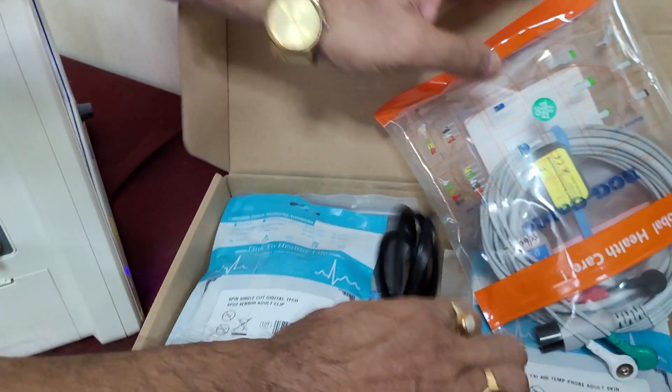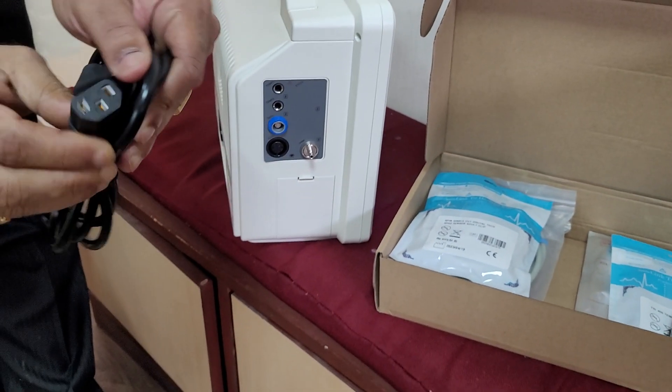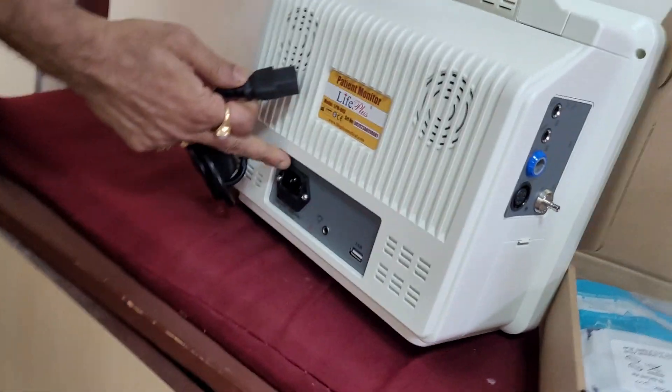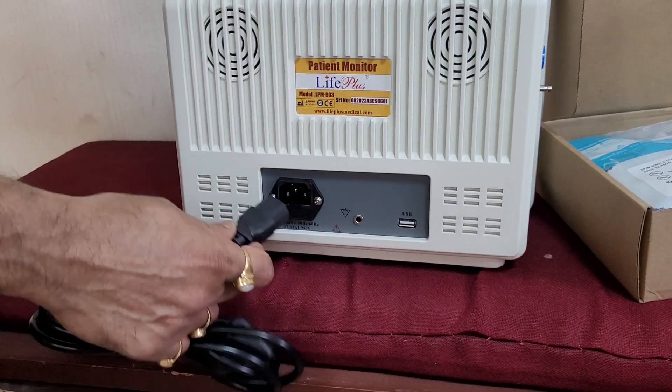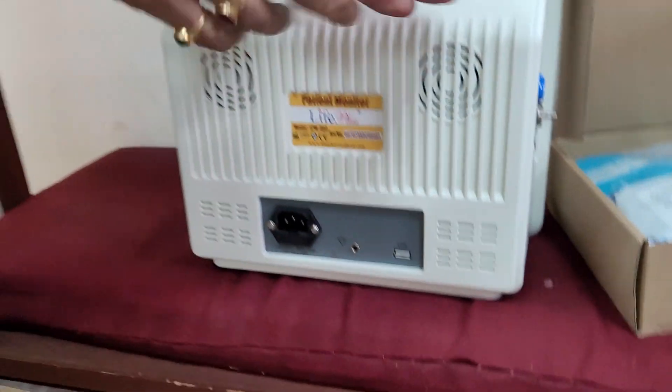First I can show you — this is a power adapter cable, which connects to this part. This part is connected on that back side, and this part is connected on the electricity side. This is a power adapter cable.